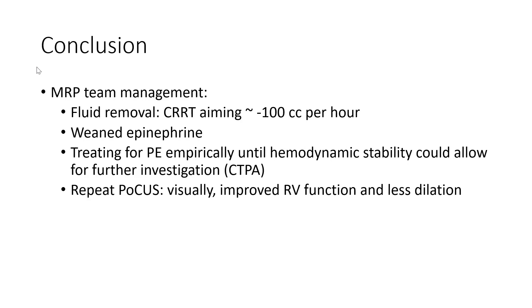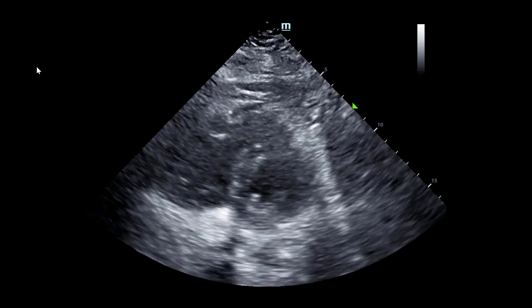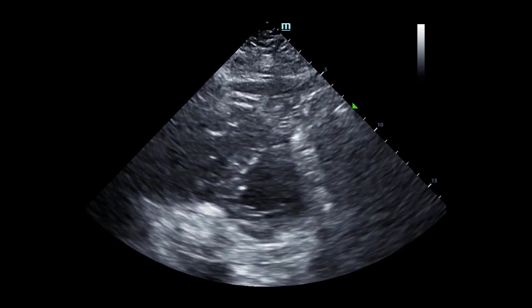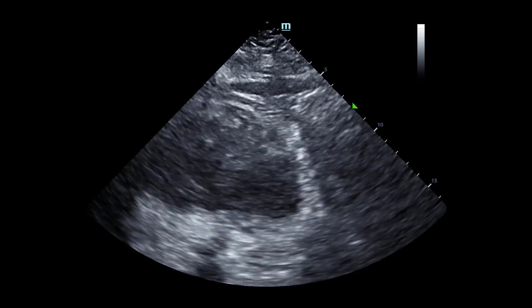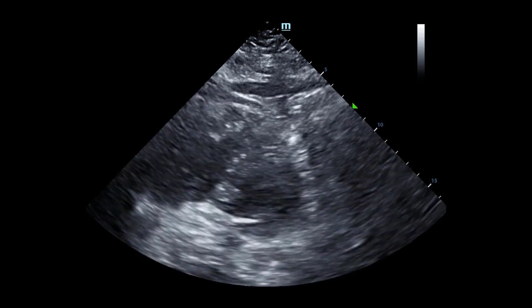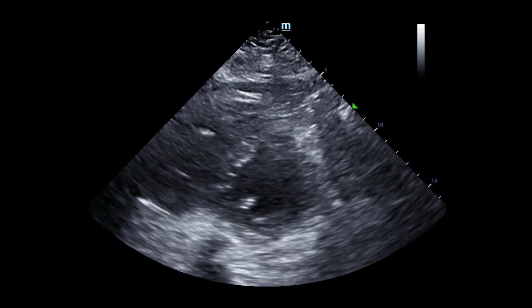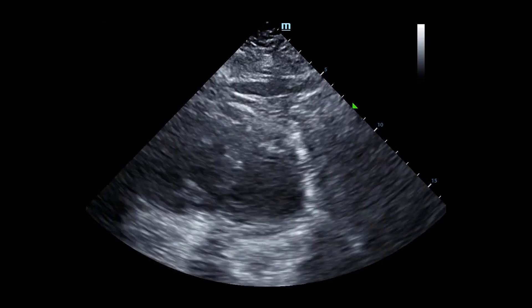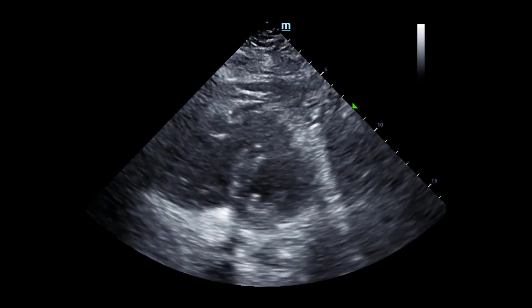The conclusion of this case was that fluid removal was implemented — the patient was on CRRT aiming for negative 100 cc per hour. The team subsequently weaned epinephrine and started treating the patient empirically for PE until hemodynamic stability allowed for further investigation with CTPA. On repeat POCUS, there was visually improved RV function with less dilation. The repeat parasternal short axis shows that the RV configuration is no longer D-shaped, having taken a more circular configuration, indicating the patient was in an element of volume overload, and with volume removal, the RV generated a better stroke volume and returned toward its normal configuration.